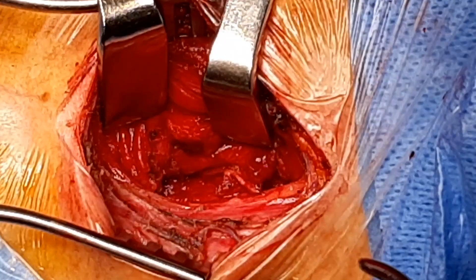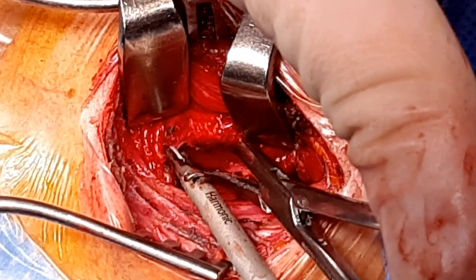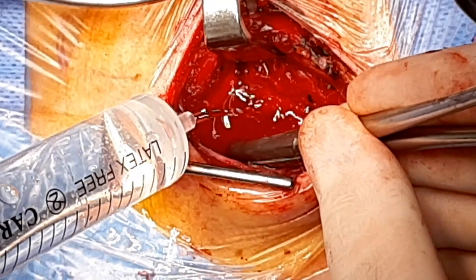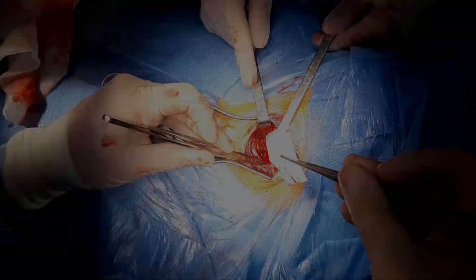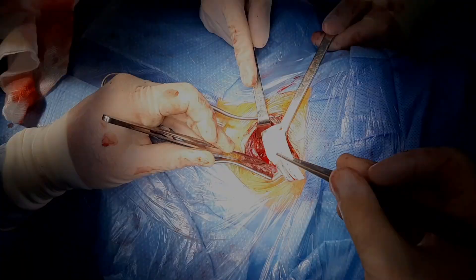The procedure was one hour long. The stump is now tested under water: we ask the anesthetist to retract the NG tube into the esophagus and inject air; the test is negative. Additionally, over the stump we left a hemopatch to reinforce the suture line.